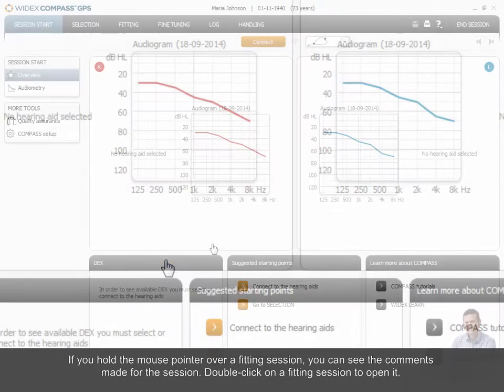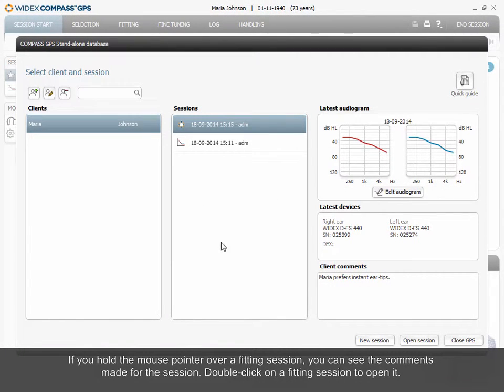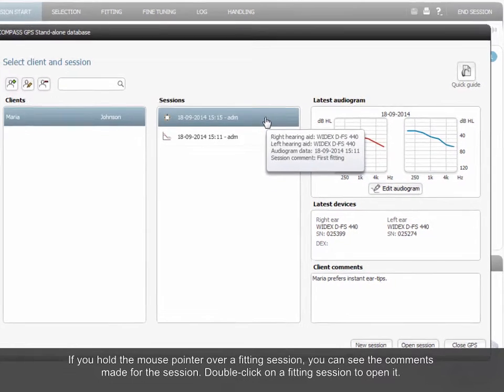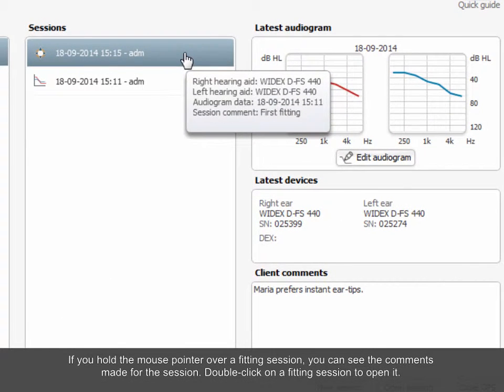If you hold the mouse pointer over a fitting session, you can see the comments made for the session. Double-click on a fitting session to open it.